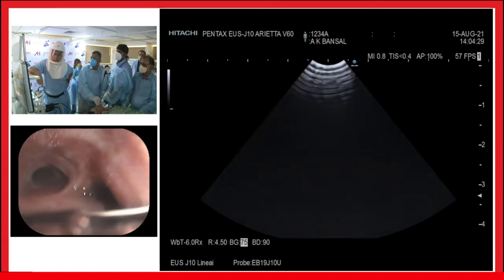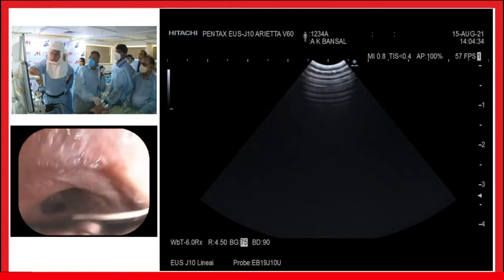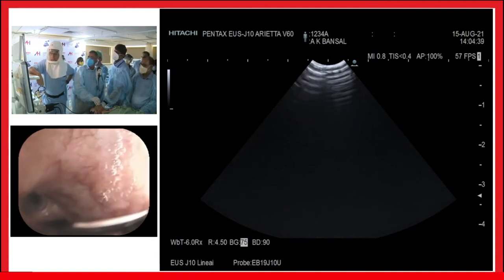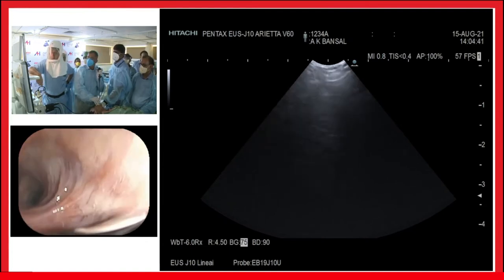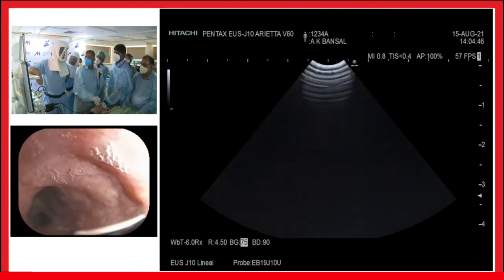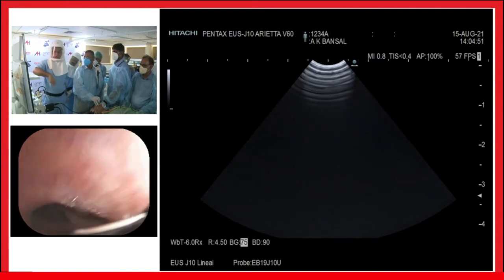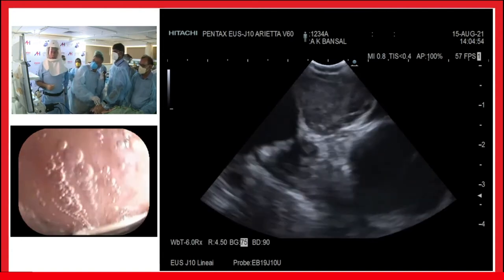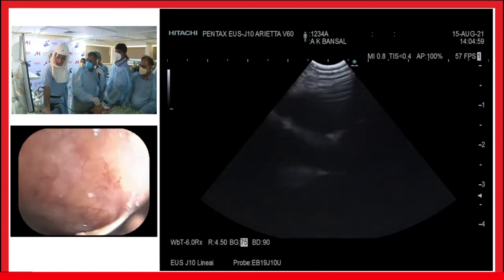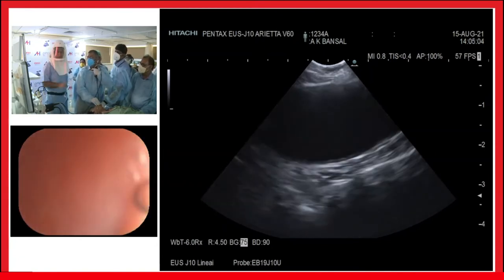So just to complete the survey, we finished 4L. Let's get inside a little more. This is the takeoff of the left upper lobe and the lower lobe, and at the carinal spur here, whatever you will see will be. Can you show me 11? Going to the left lobe, show me the descending aorta. Because if you go to the left bronchus and move much more to the left, you will be able to see the descending aorta. You are seeing anterior structures. All you have to do is rotate more anticlockwise, yes, and you will be able to see the descending aorta.